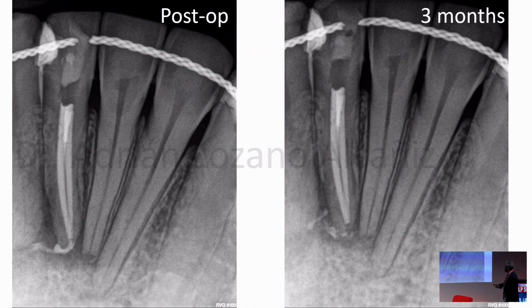So this is the post-op, and here we have the 3 months, and I know that is a short recall, but it seems that the lesion is smaller. At least I think so.